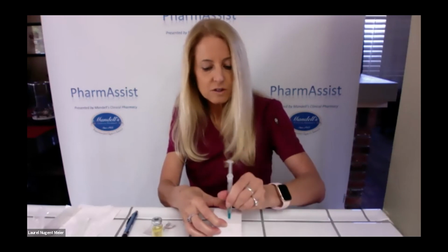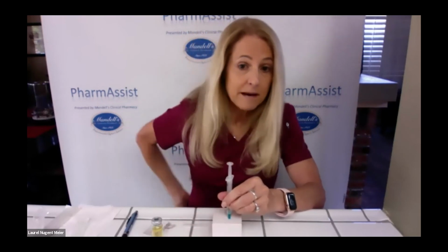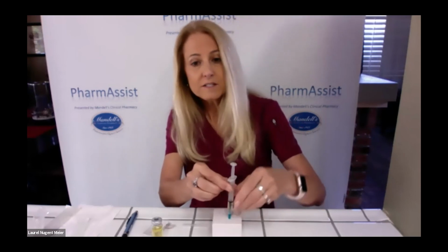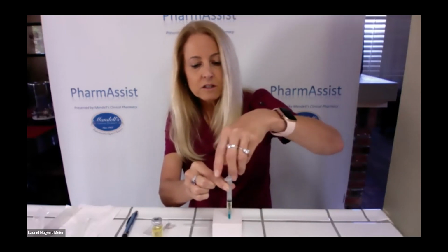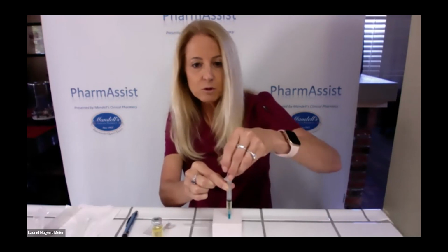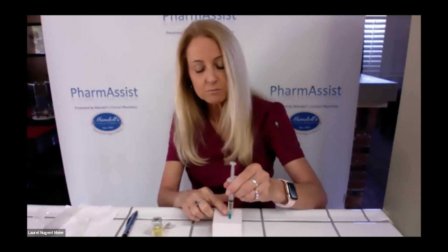The tickle technique is just a little bit of tickling, and then you go straight in like a dart. Now, if you're in the dorsal gluteal site, which is that upper outer quadrant of the buttocks in the back, you're going to want to aspirate. And what that is, is pulling back on the plunger and looking for blood return. You're not going to pull real hard, but you're going to pull a little bit and look to see if blood comes into the syringe.